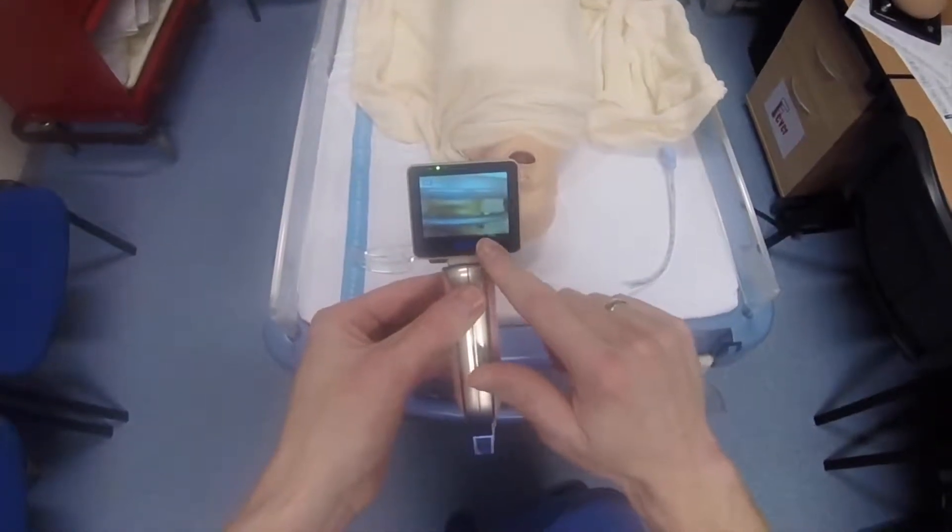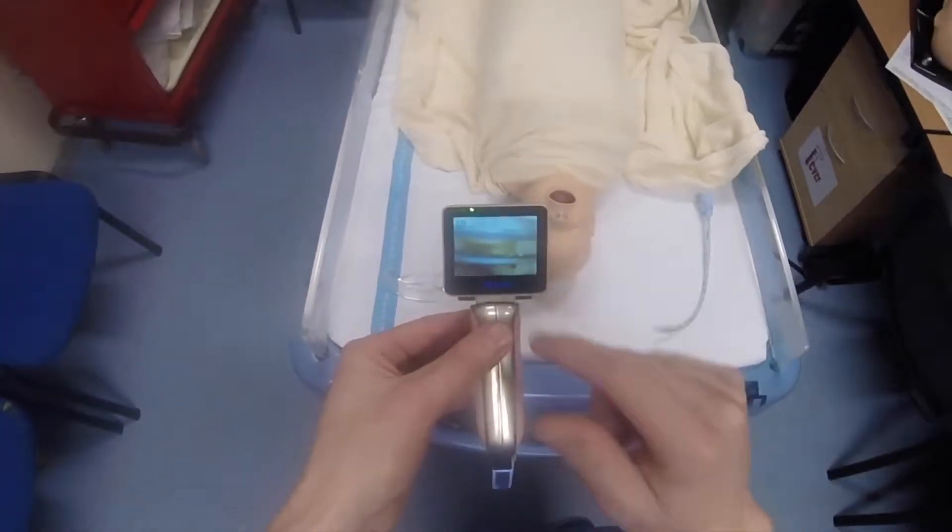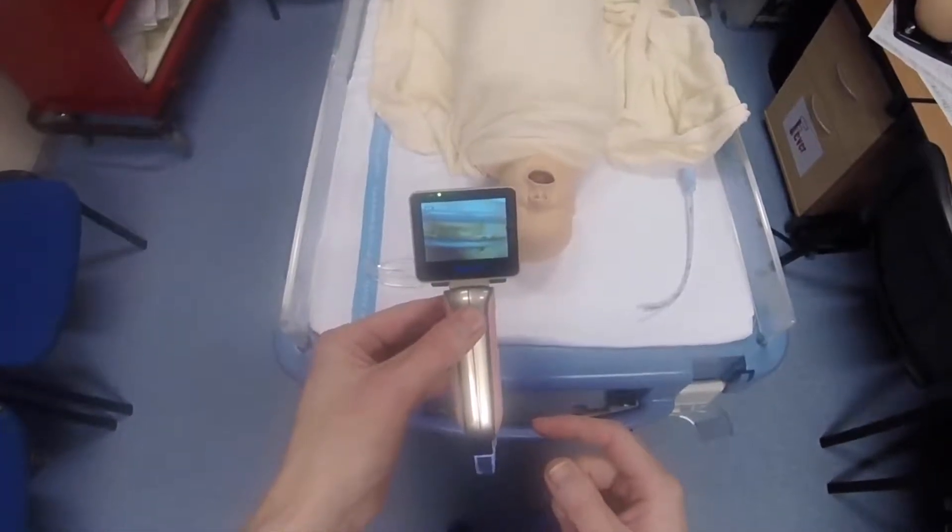On the display you've got the date and time at the bottom and a battery indicator in the top left-hand corner.